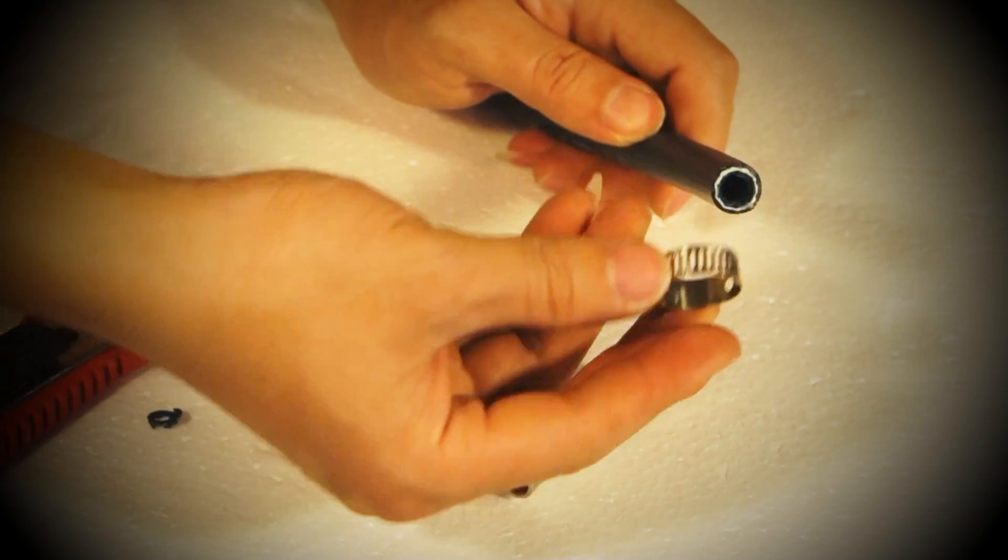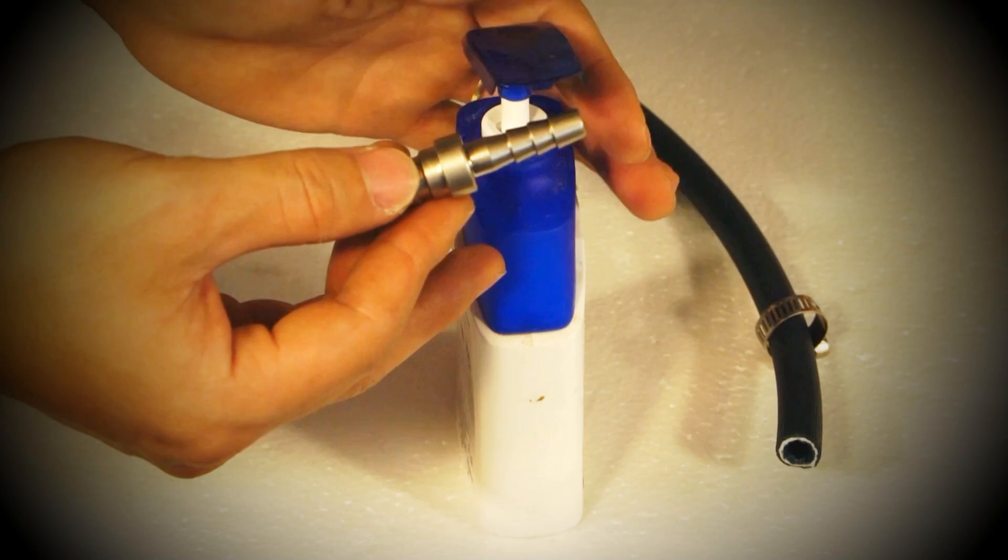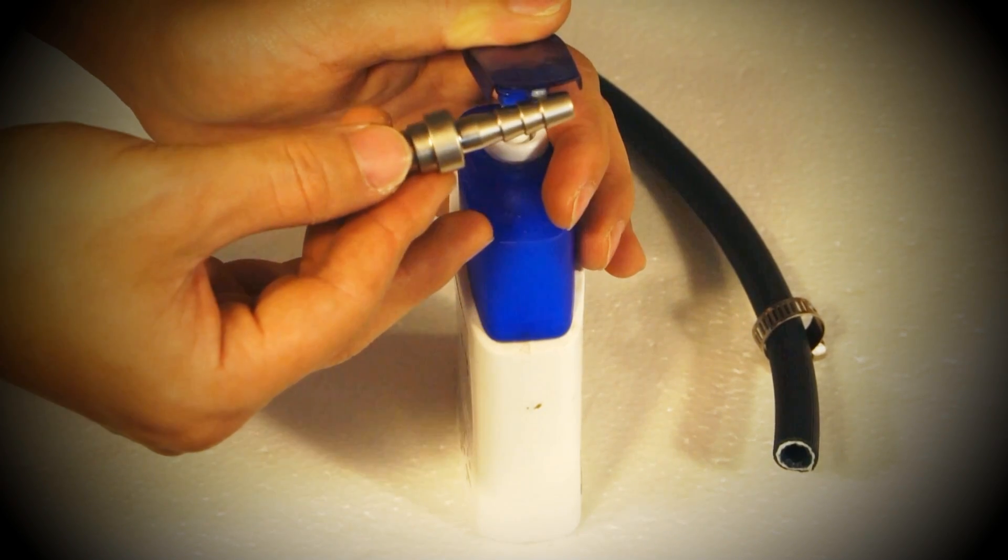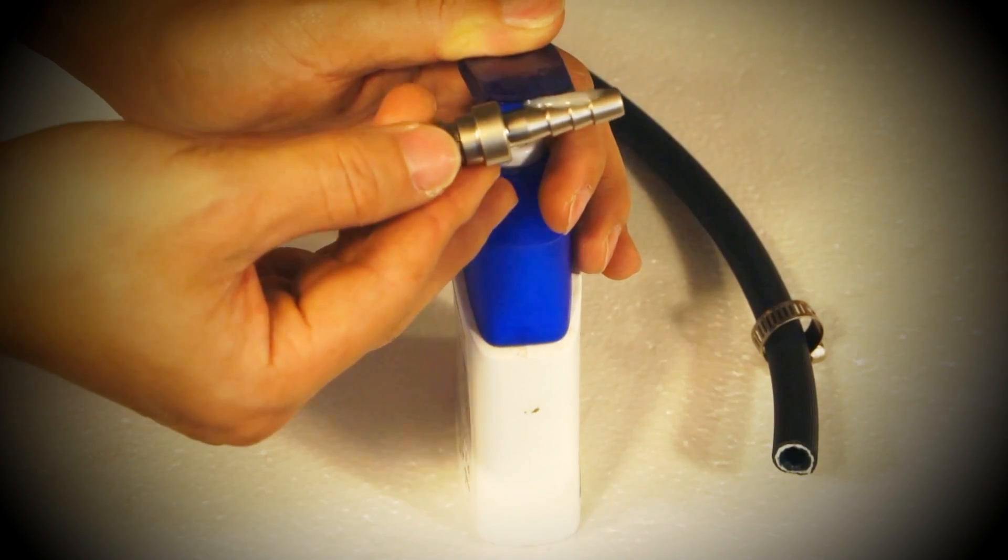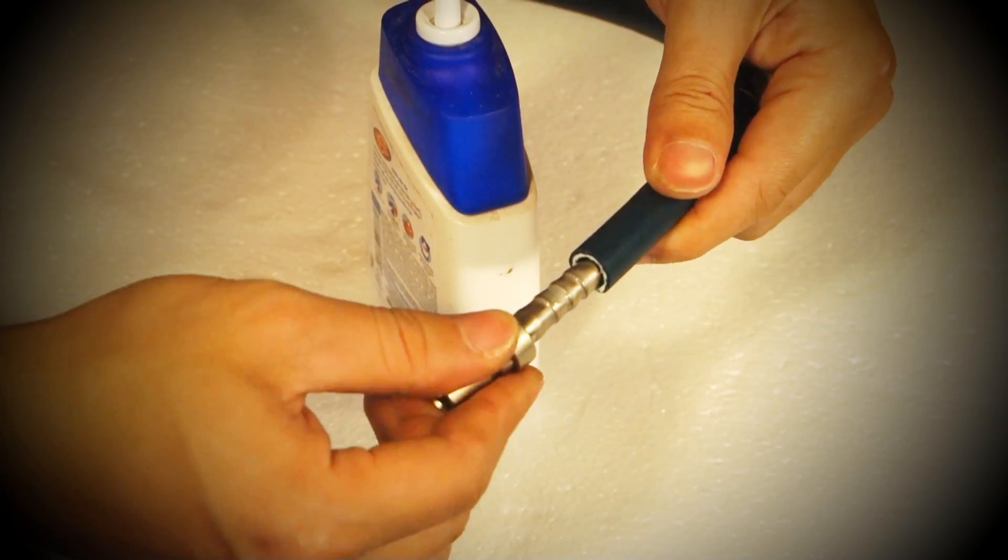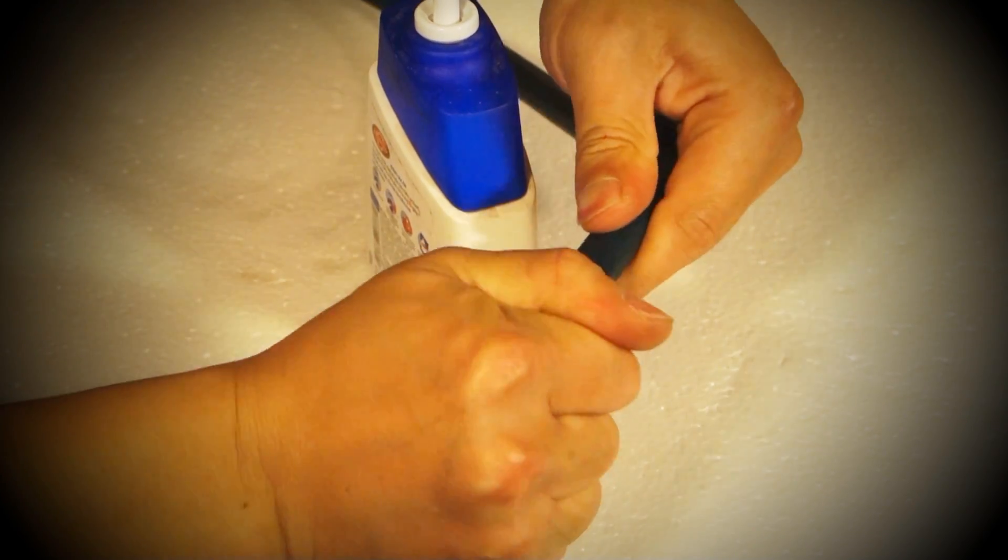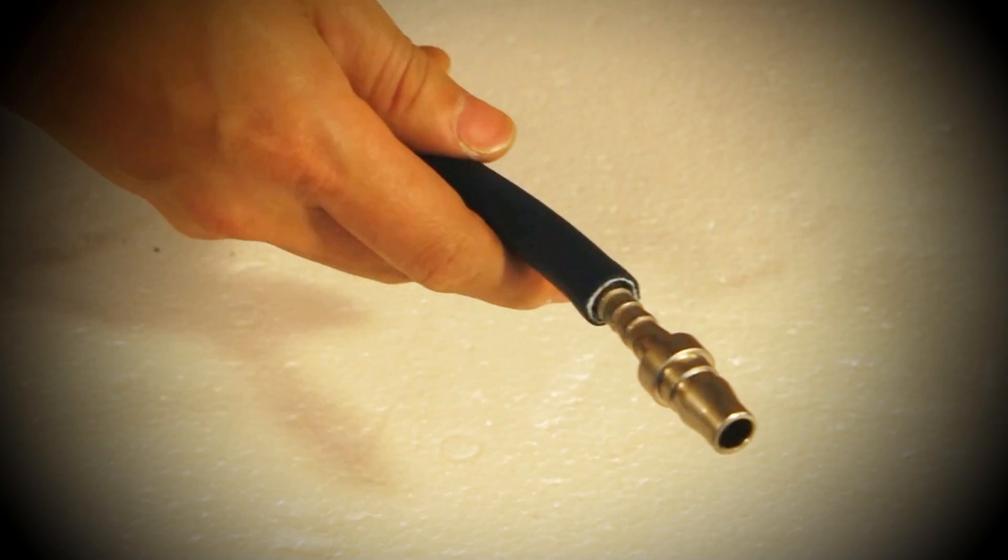Once the tube is ready, slide the ring clamp onto the hose. To make insertion of the connector easier, you can apply a small amount of hand soap to the connector. This will act as a lubricant. Now insert the connector into the hose. It will require some force.